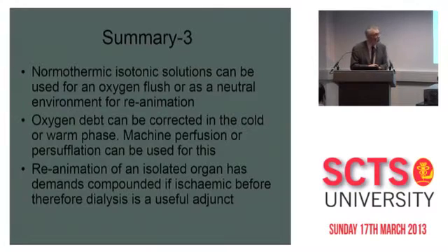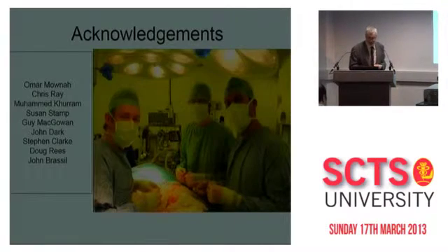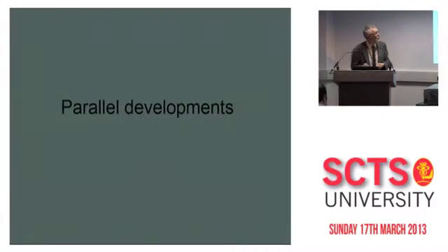the same. So normothermic isotonic solutions can be used for an oxygen flush or as a neutral environment for reanimation. Oxygen debt can be corrected in the cold or in the warm phase. Machine perfusion or persufflation can be used for this, and then you can actually reanimate the organ on a rig. So these are some of the people who have been involved.